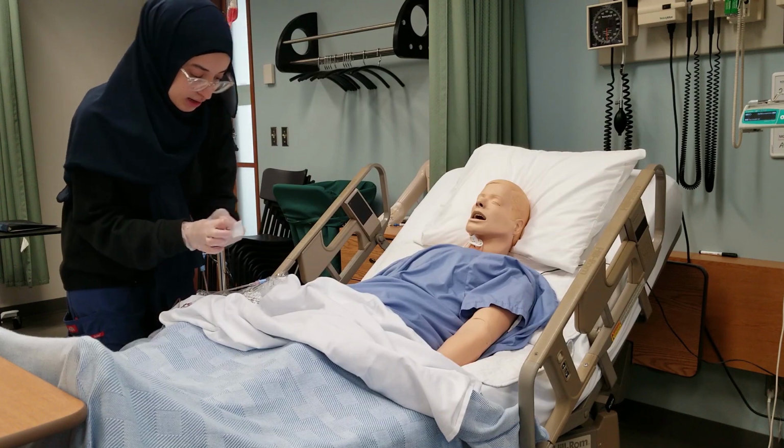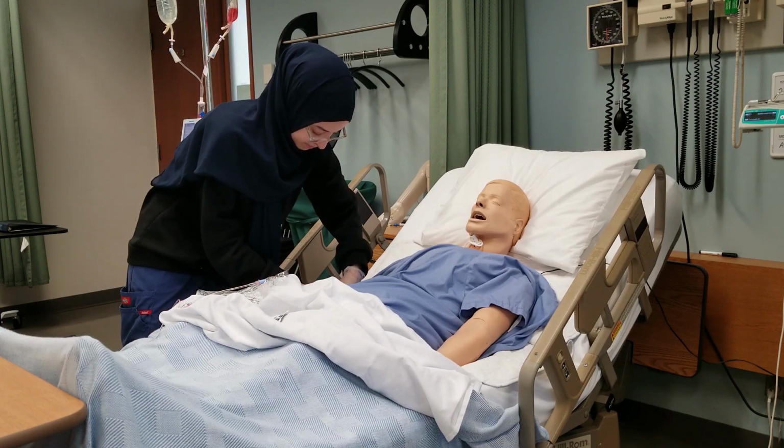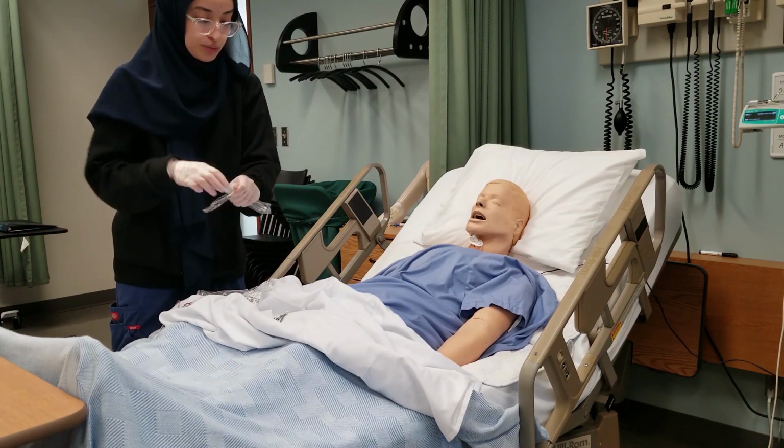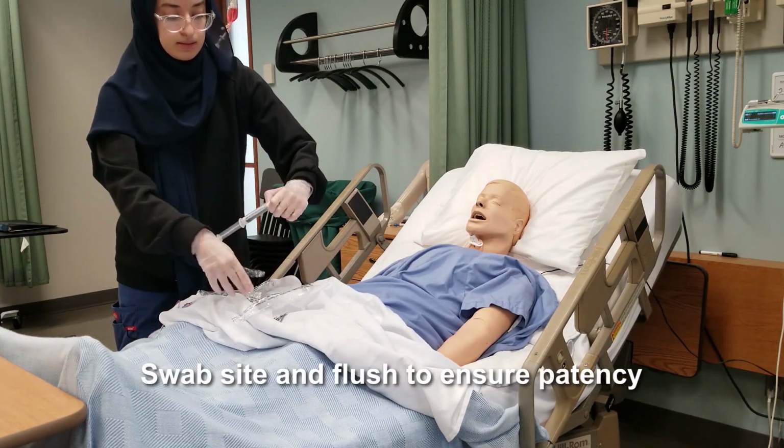So I'm just going to swab your IV. And then this is a peripheral IV, so I'm only going to flush with 3 mLs.